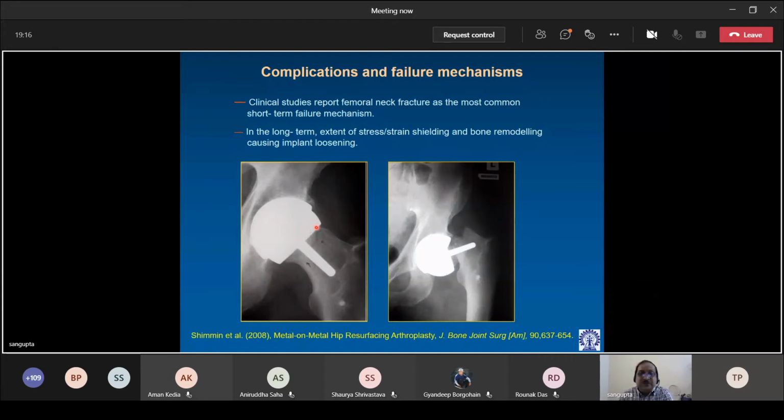Resurfacing is a minimally invasive implantation procedure of the hip, where you can see the prosthesis looks like a mushroom, and we only machine off the articular surface of the hip so as to fit, because as you know, due to degenerative diseases, the cartilage and the femur head bones are somewhat degenerated. So we do resurfacing of the femur head without cutting off, without resecting from the neck. So total hip arthroplasty and hip resurfacing are essentially different. In hip arthroplasty, we would chop off the whole portion from the neck and a full femoral implant would go inside.